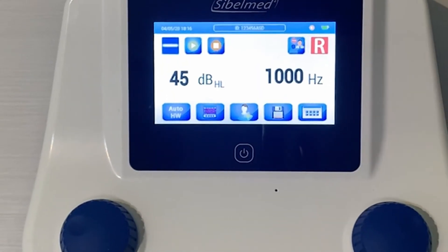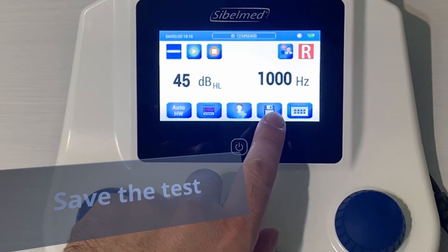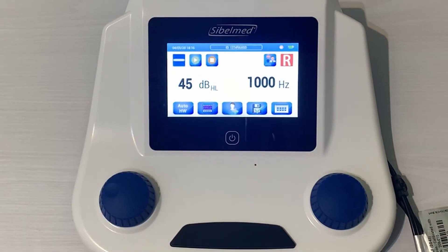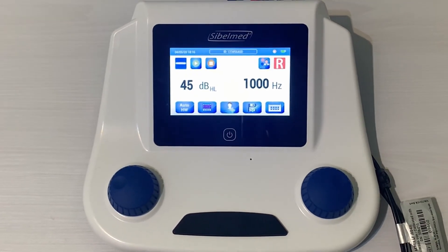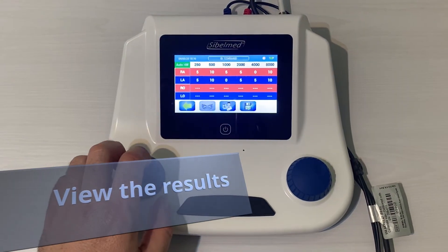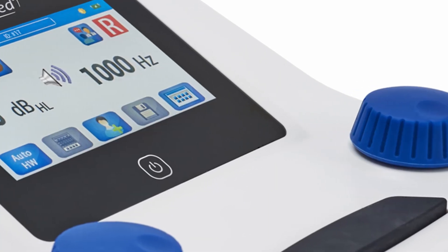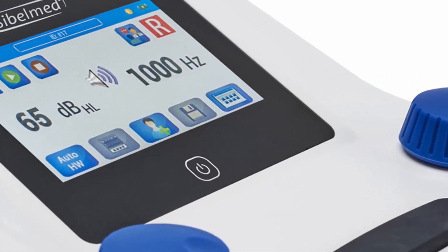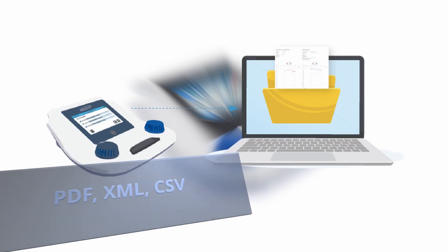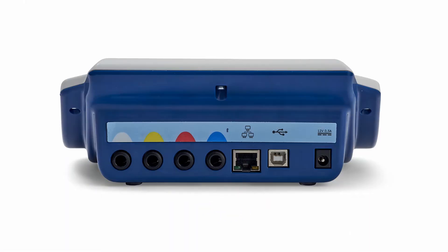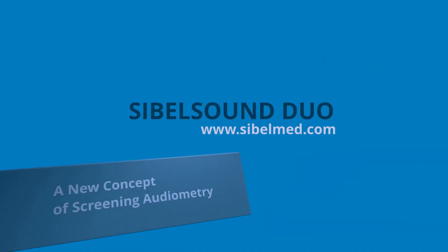Press this icon to save the test. This icon will be used to display the saved thresholds and diagnoses. If the data export option is available and automatic export is on, the files will be automatically sent to your network. Sybil Sound Duo — a new concept of screening audiometry.